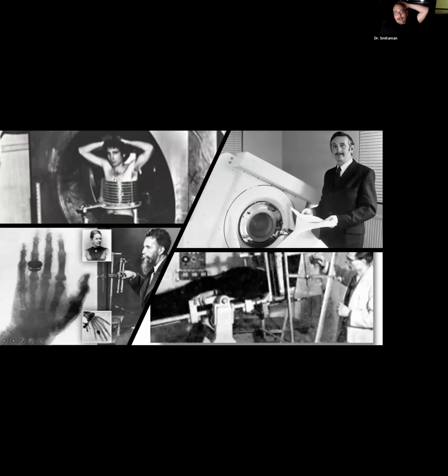And then top left, moving on to Raymond Damadian and his assistant, pictured here, Larry Minkoff, in the late 70s, imaging the chest under MRI. As we know, MRI is going to be the workhorse for muscle imaging. It displays the structure of muscle very well with its intertwined fat, which is bright on T1, and fascia, while T2 and STIR imaging is highly sensitive for fluid, edema, and muscle swelling.